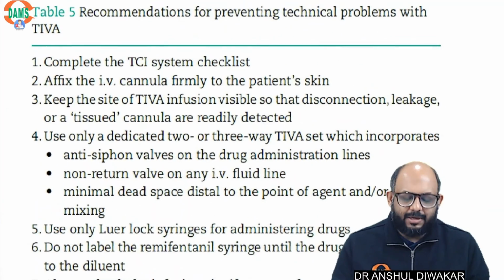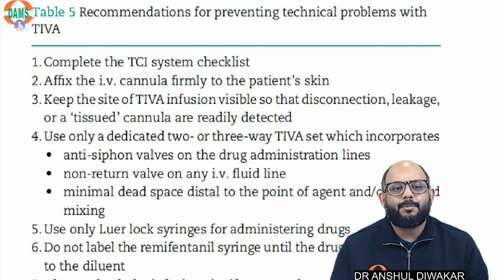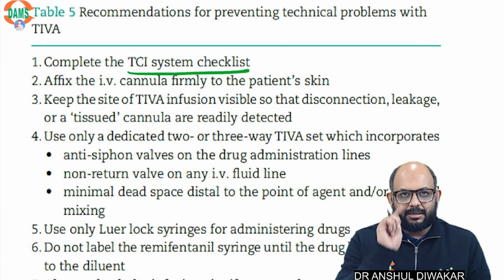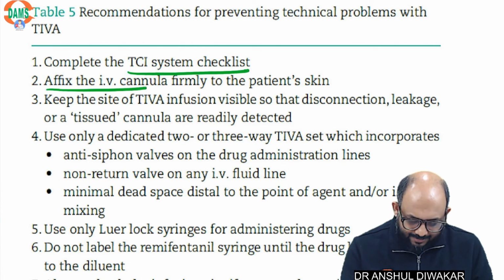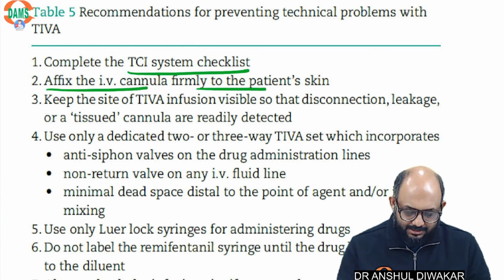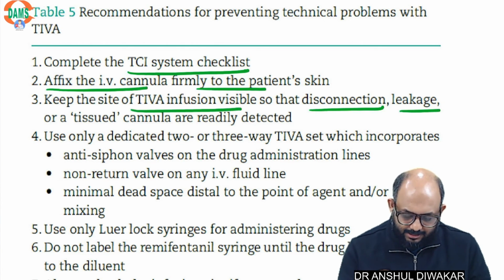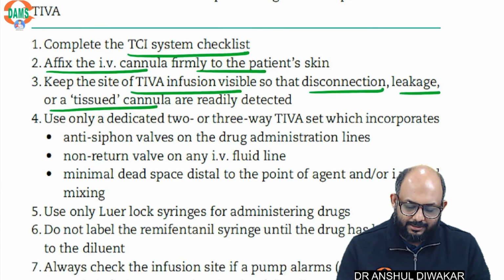Okay. Now recommendations for preventing technical problems with TIVA. Complete the TCI system checklist that we just did. Affix the IV cannula firmly on the patient's skin. Keep the site of TIVA infusion visible so that disconnection, leakage or tissued cannula is readily detected.